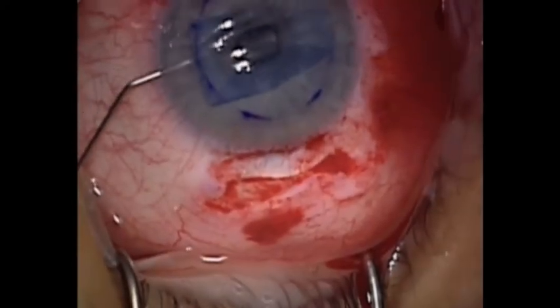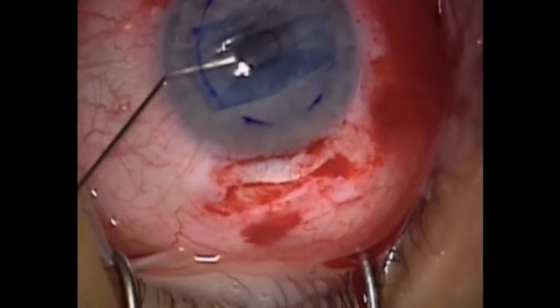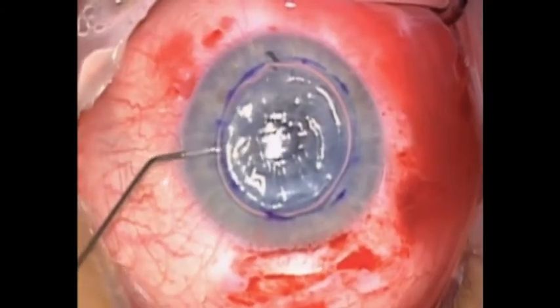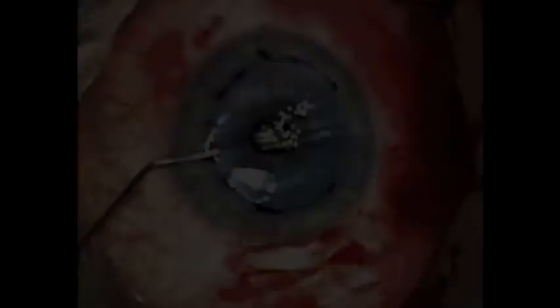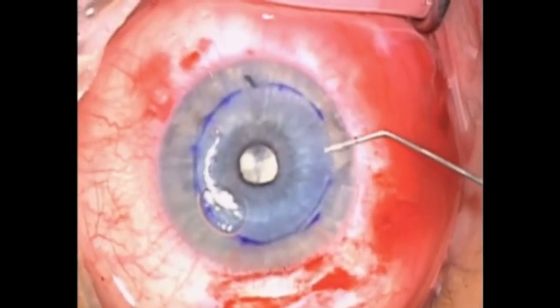The tissue can be challenging to unfold, and in some cases we place an air bubble on top of the tissue. Once the tissue is in good position, the air bubble on top of the tissue can be aspirated, and we replace this with a full air fill from underneath the donor tissue.